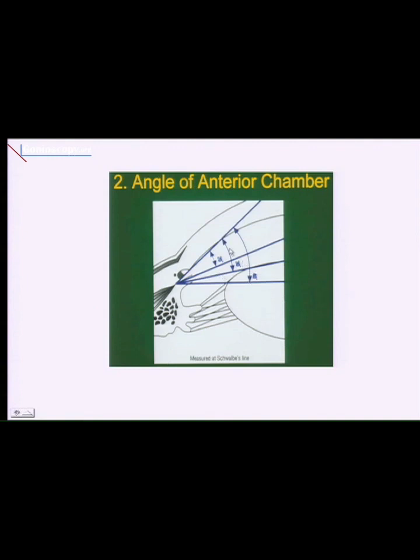So if one is going to use this system, probably it's a good idea to validate your ability to do this with some UBM patients in order to make sure that you can get that fairly accurately. It doesn't have to be more accurate than that. That's plenty good. What we're really interested in is not whether it's 5 or 7 or 10, but is it 5 or 20? So there's some range of variability, but the amount of variability doesn't need to be excessive.